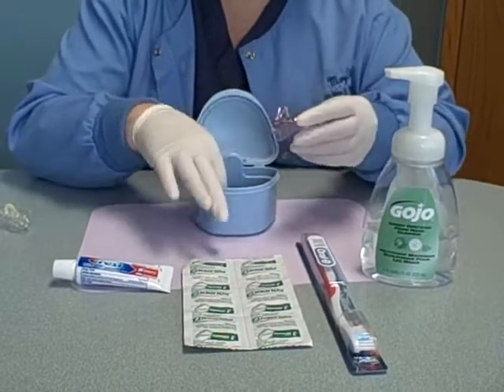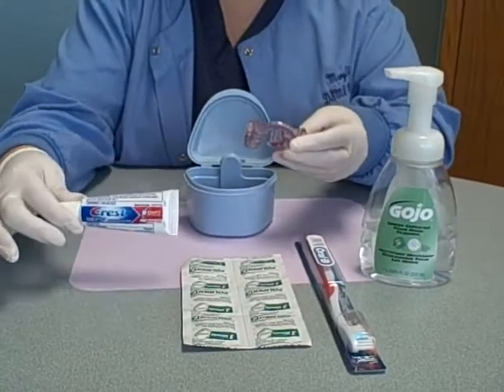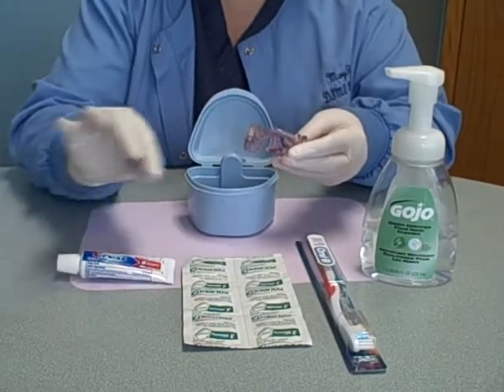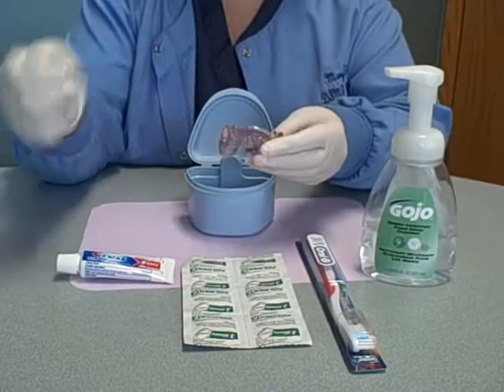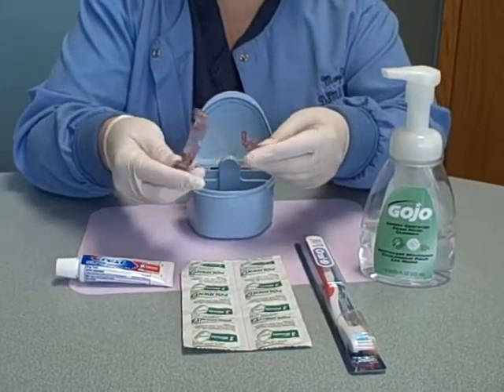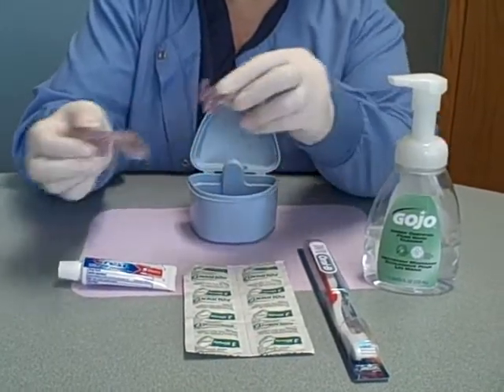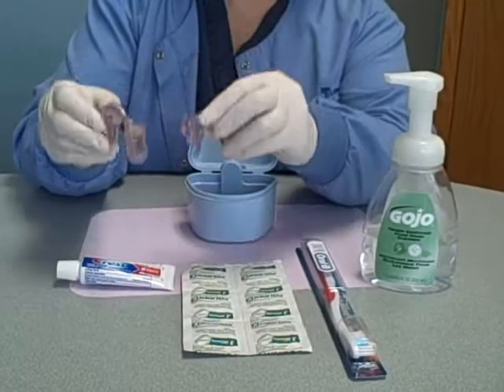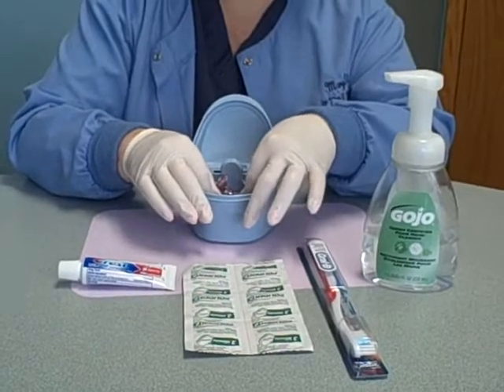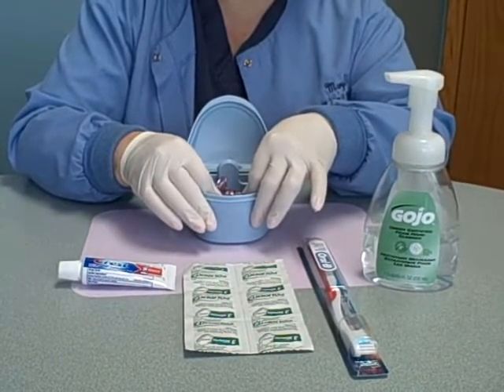The second way you can cleanse your oral appliance is to use a toothpaste and a toothbrush. A soft toothbrush is highly recommended. Put some toothpaste on the brush, put it under some water just to soften it, and gently cleanse it. You can also use a liquid soap, rinse it out under the tap, shake off the excess water, put it back into your container, and leave the lid open so the appliance can air dry during the day.